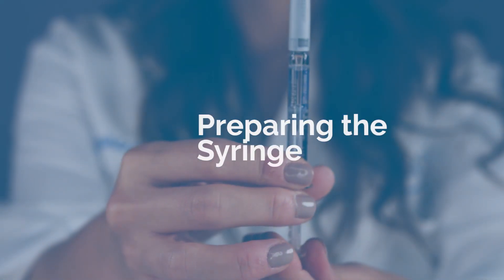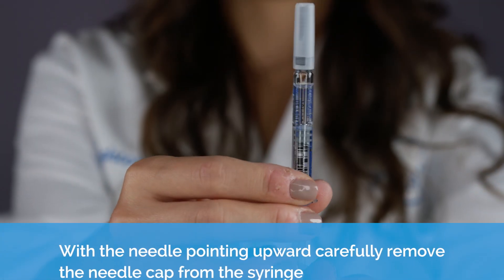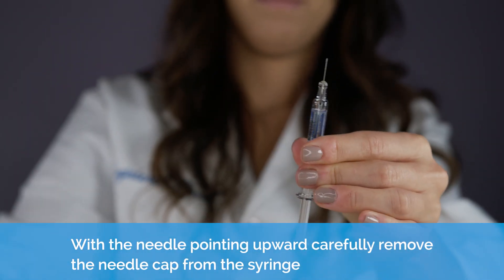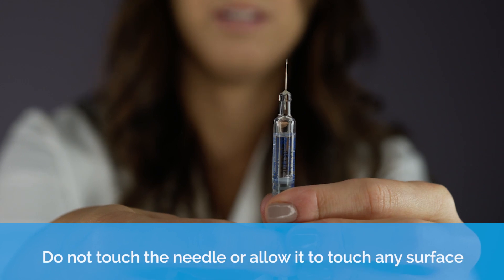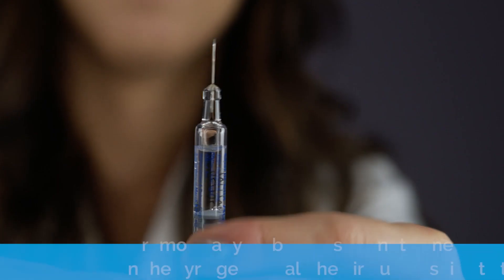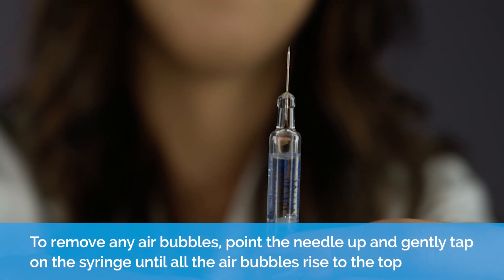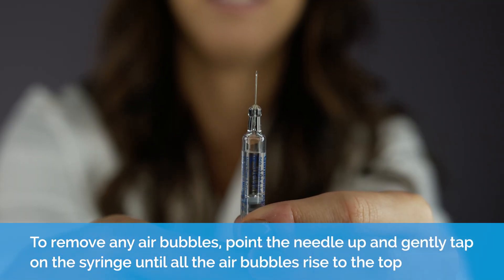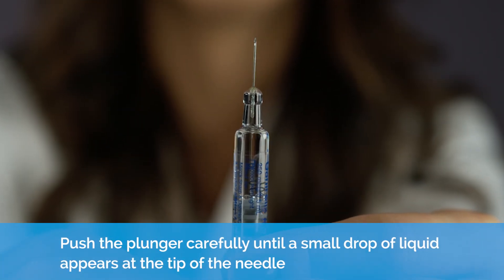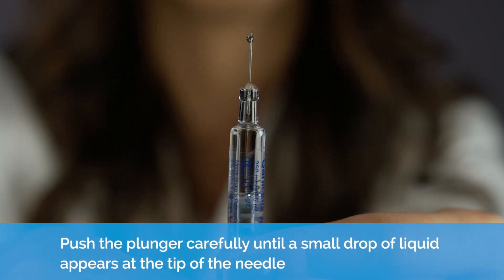Preparing the syringe. With the needle pointing upward, carefully remove the needle cap from the syringe. Do not touch the needle or allow it to touch any surface. To remove any air bubbles, point the needle up and gently tap on the syringe until all the air bubbles rise to the top. Push the plunger carefully until a small drop of liquid appears at the tip of the needle.